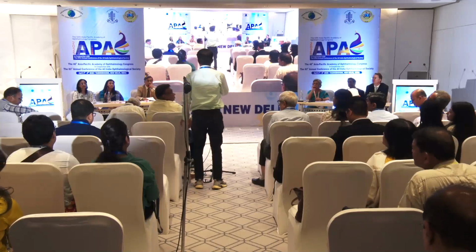Thank you, Dr. Sagrika. Now, before, yeah, go ahead. Is there any significance of age when we register for doing an OCT?